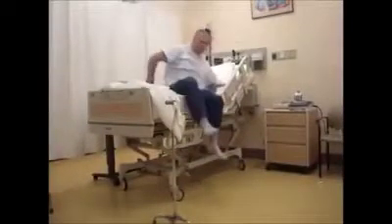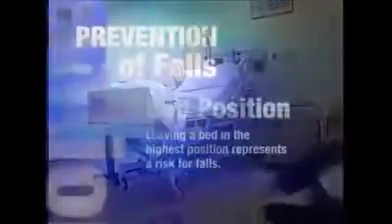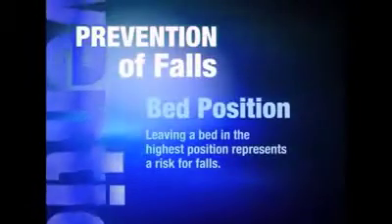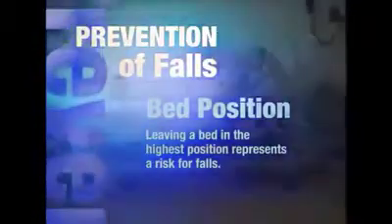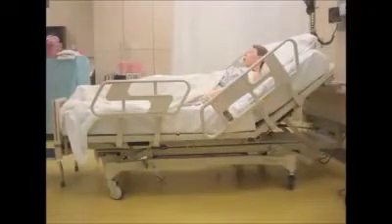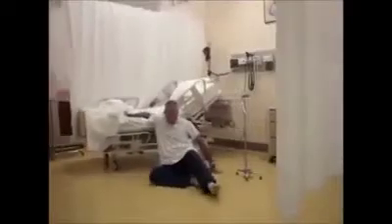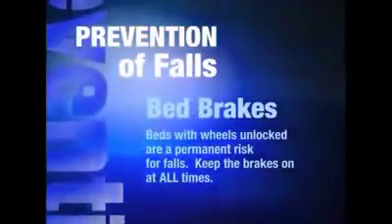Leaving the bed in the highest position represents a risk for falls. When you are ready to leave the room, make sure that the patient's bed is in that lowest position. Beds with the wheels not locked are a permanent risk for falls. Keep the brakes on at all times.